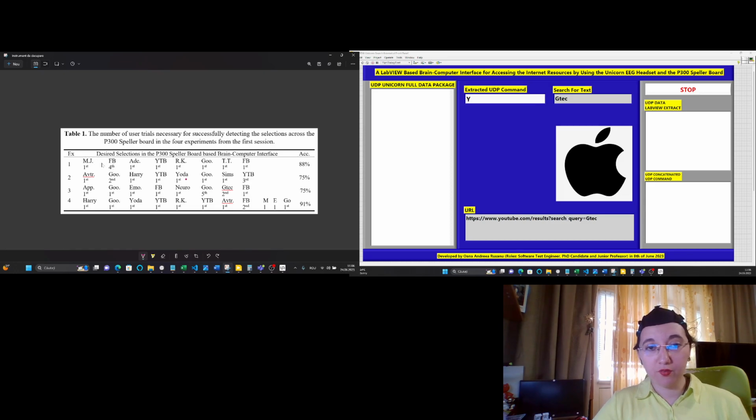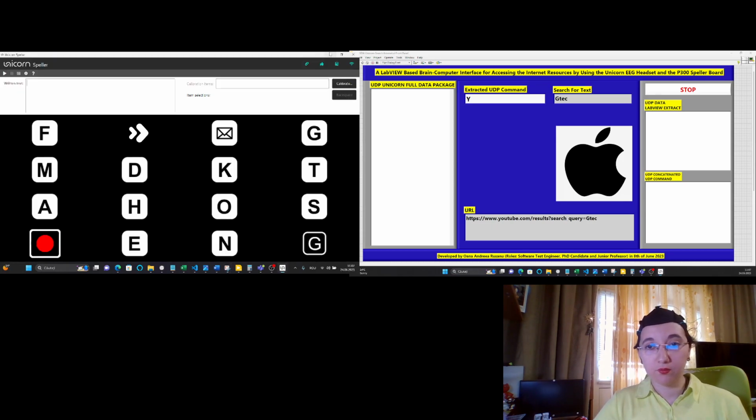Then I will search Michael Jackson on Facebook. I'll continue with Adele. I will search Adele in YouTube. Then I will try to detect the Ronan Keating symbol and I will look for Ronan Keating in Google. And lastly, I will try to detect Tina Turner and I will search for Tina Turner in Facebook.